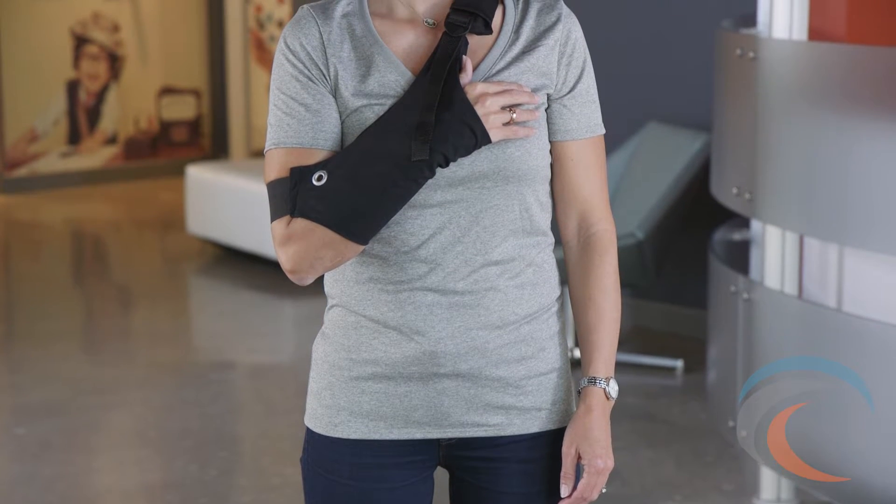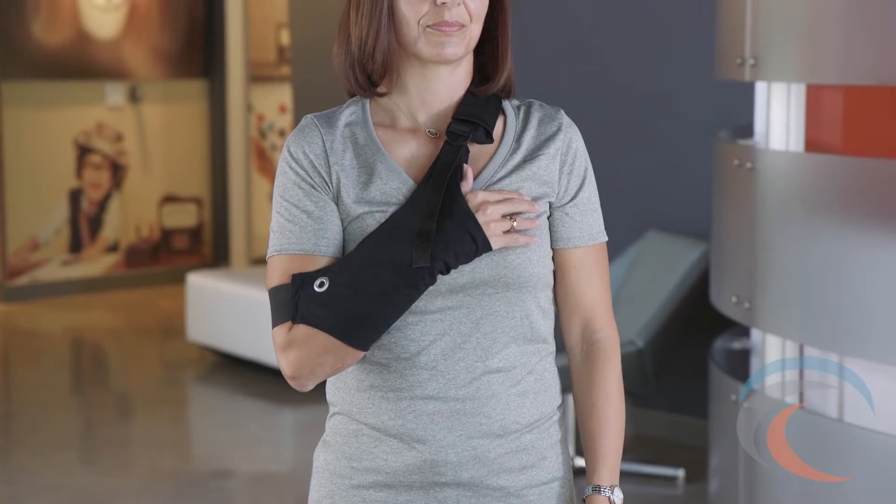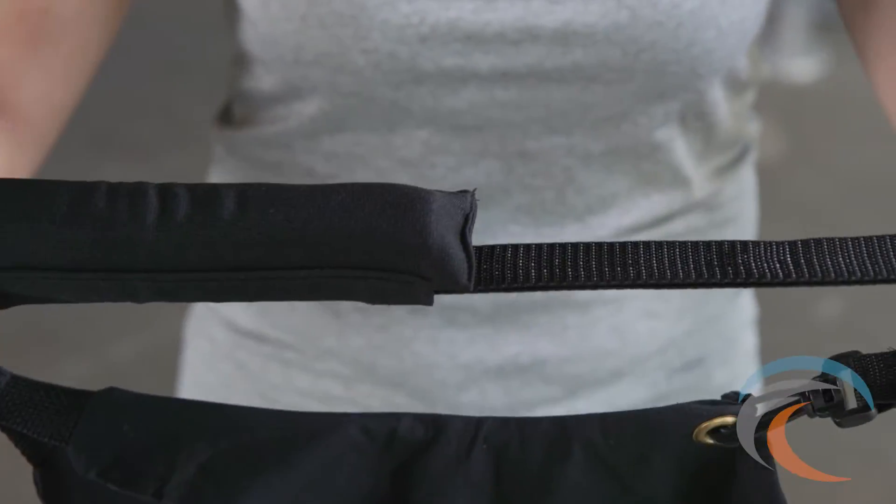Wingsling is designed to easily and comfortably elevate the hand and wrist above the heart following surgery or injury. It can be sized to a custom fit by sliding the standard buckle in the appropriate direction.